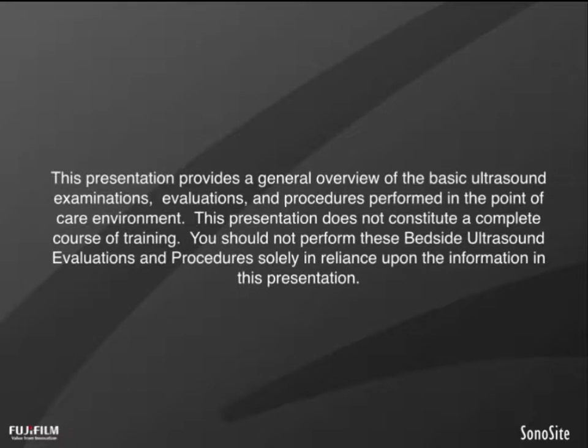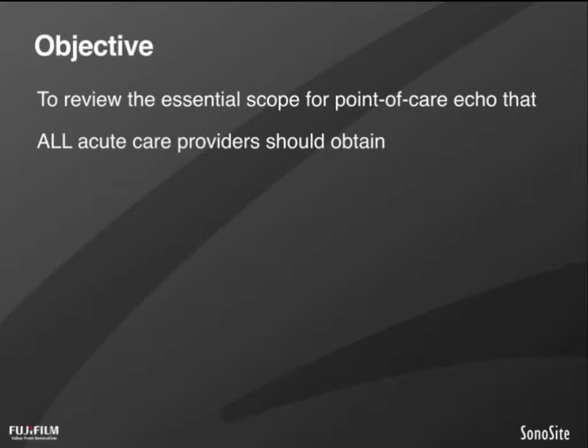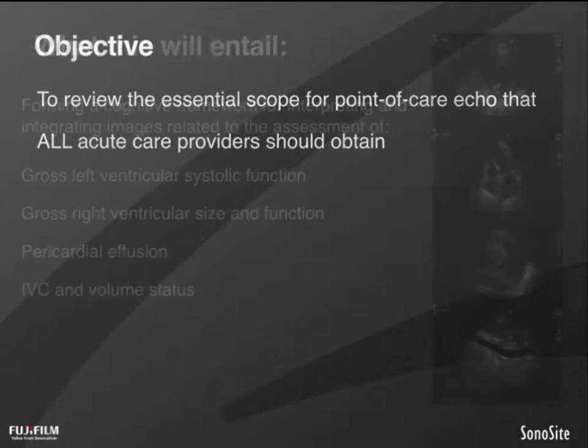As with any presentation, you must take this with some grain of salt, and in particular, you must understand that expertise and comfort with point-of-care ultrasound is arrived at only after doing hands-on training and ideally significant hands-on supervision and mentoring. As mentioned, the objective of this presentation is to review the essential scope for point-of-care echocardiography that all providers of acute care should understand and obtain.